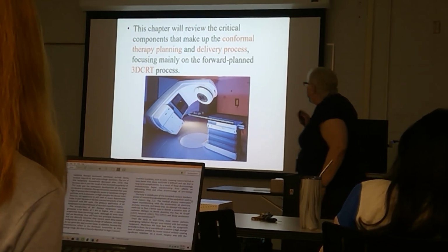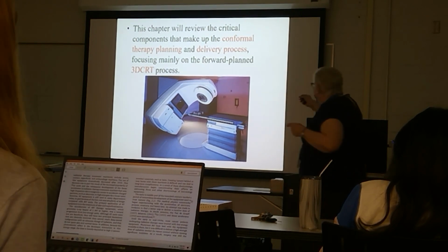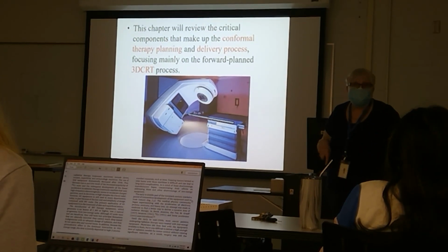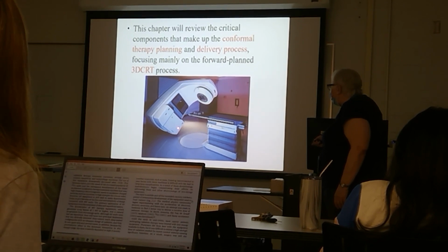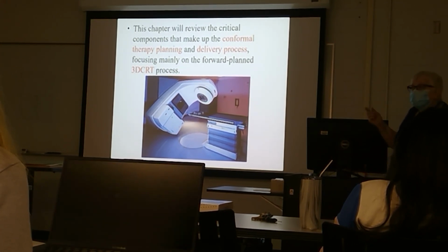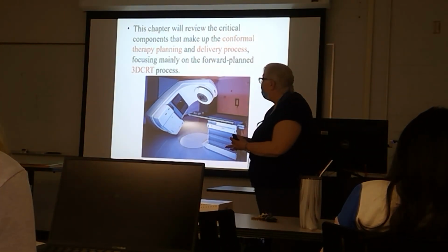Okay, so just for talk's sake, the lasers here will say are green. There are lasers that come out of this and this that are red, so they don't get confused with the 3-point setup.